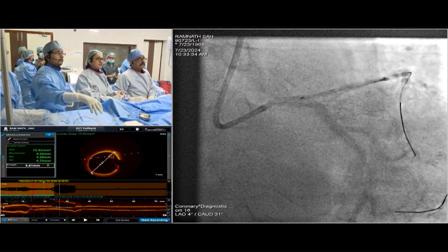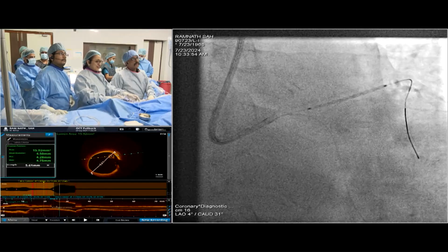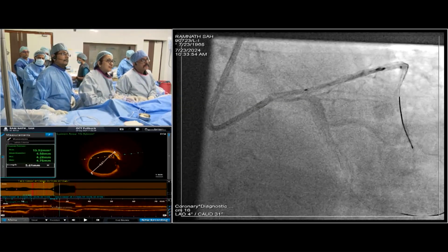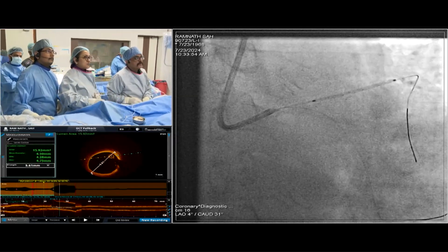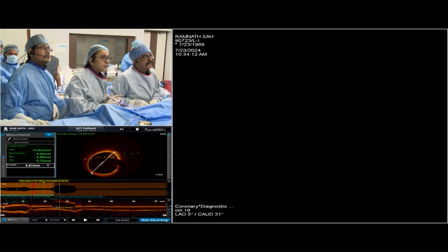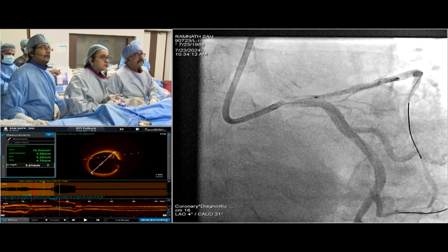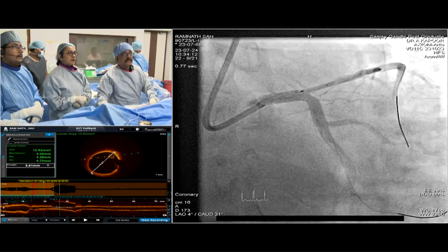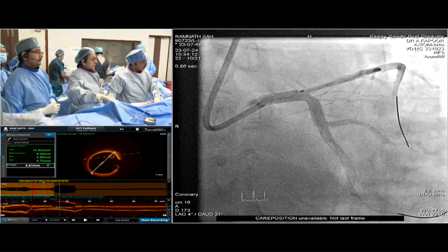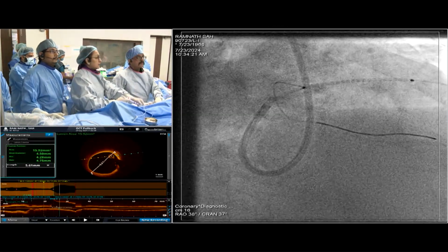So that's a technique. If suppose the flow stops, at least we can just place it. I think it looks fine, sir. Let's see. So we can just place this in the proximal part. Take a breath slowly. Yeah, so this looks okay. Distal, cranial, then caudal, we can just see the caudal, proximal part.